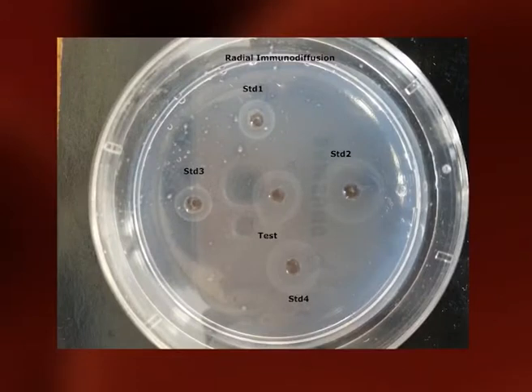Serological assays involving antigen-antibody interactions are one of the most important aspects of forensic serology. Apart from identification of the body fluid with the help of the antigens present in them, it also aids in the identification of the species from which the fluid originated.